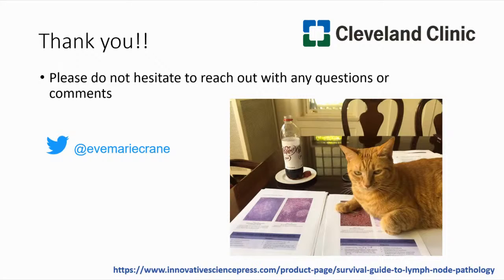Thank you. So there is another question. I think this is from a resident. Can you explain how to differentiate BCL2 between a reactive lymph node and a follicular lymphoma? Because BCL2 is normally a T cell marker.